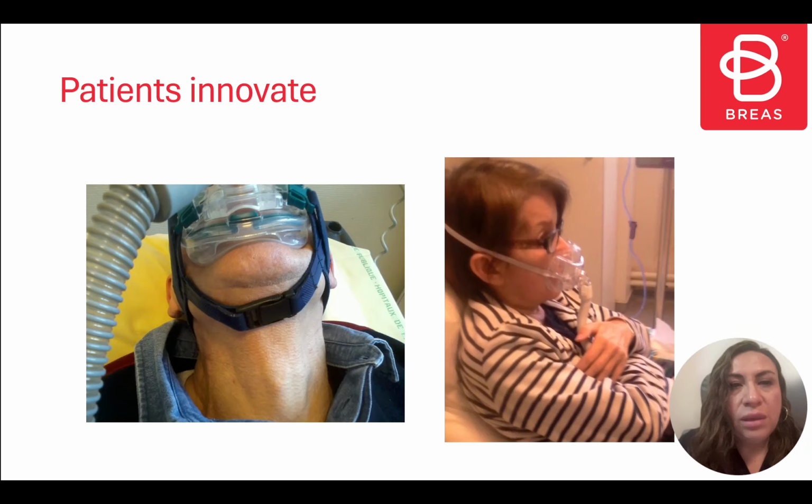This patient, in fact, sometimes wanted to use this type of mask during the day, but she wanted to take it off easily. And as we can see, she has a deficit in her hands, so it's difficult for her to completely remove the mask. So she had changed the headgear for a small elastic band that she could unhook quite easily. Of course, probably there were leaks, but it was hard to say no, because either she was using the mask, even with a little leakage, or not at all. It was the best compromise for her.